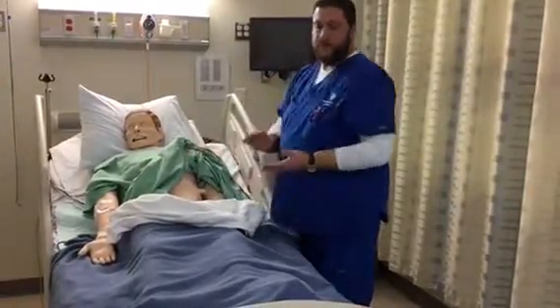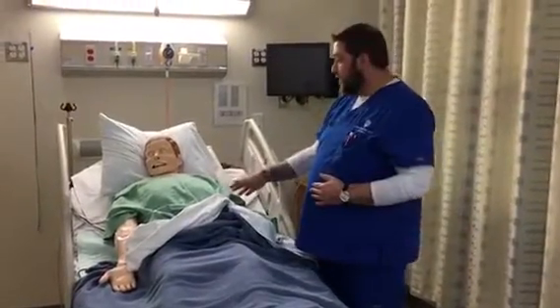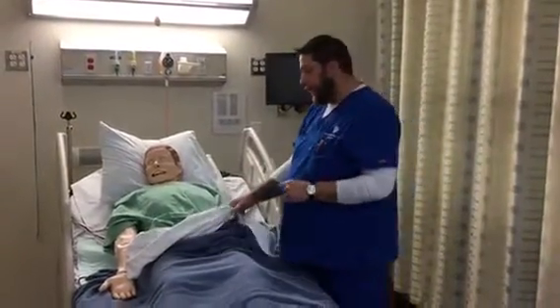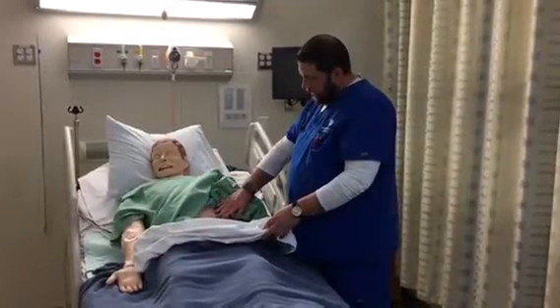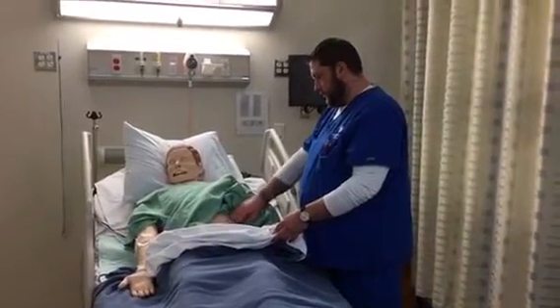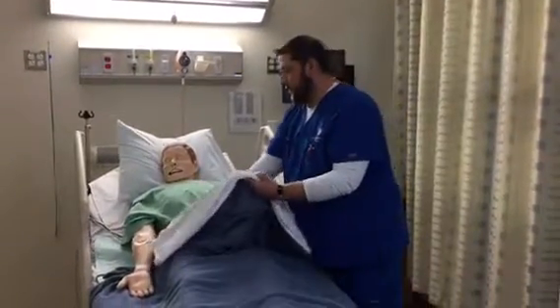What we want to do is, again, we're going to introduce ourselves to the patient. Hi, my name's Troy. We're here to check on you. Going to perform hand hygiene, come back with a clean technique. We're going to examine the site. We're going to just palpate gently around it. What we're looking for is any signs of crepitus, any crackling, anything that could show that it's not correct.